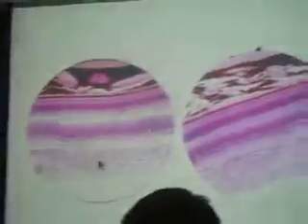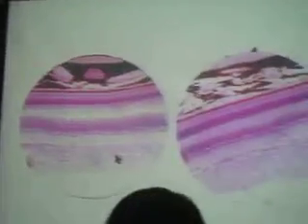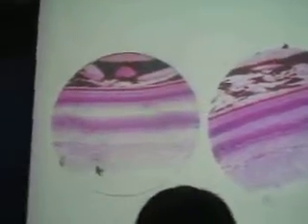Okay, so after your ganglion cell layer, you have the axons of your ganglion cells. And then, not ordinarily shown, will be the outer limiting membrane and the inner limiting membrane as the 10th layer. Okay? You can remember?